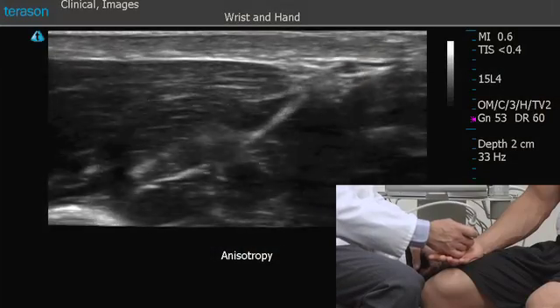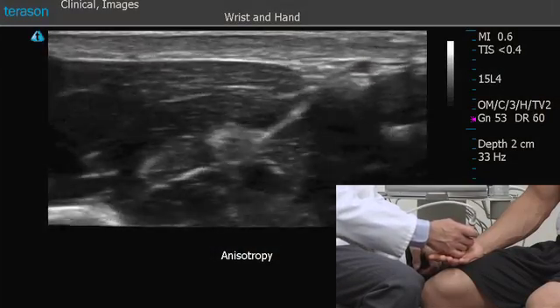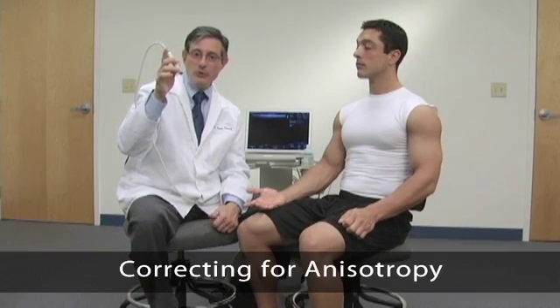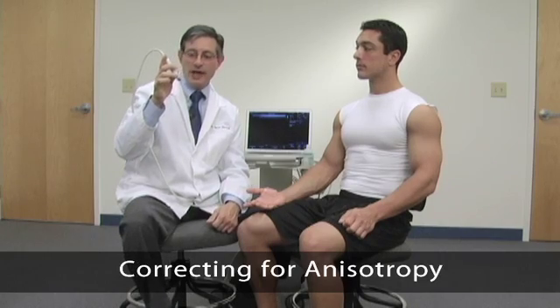So if you're looking at this tendon in transverse and you tilt the probe slightly superior or slightly inferiorly, the tendon will go from being a very bright structure to being a dark structure. We want to see a nice, bright tendon outline. We have to be very careful about how we position the probe relative to the tendons, muscles, and tissues that we're looking at. We want to get the probe as perpendicular to the structures as we can.